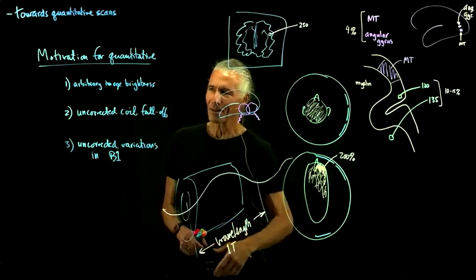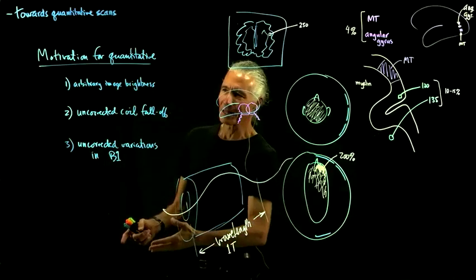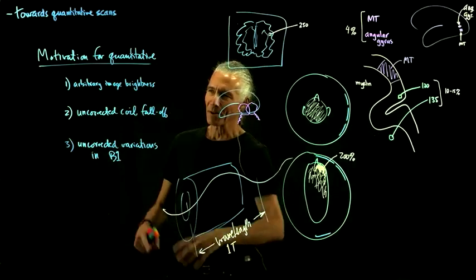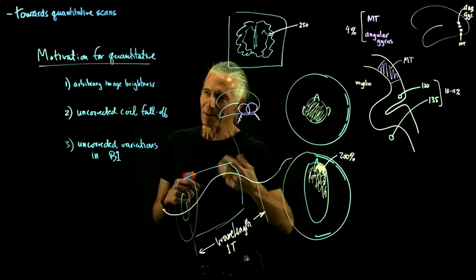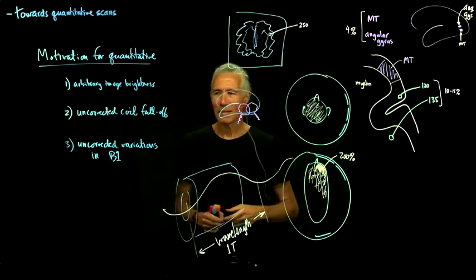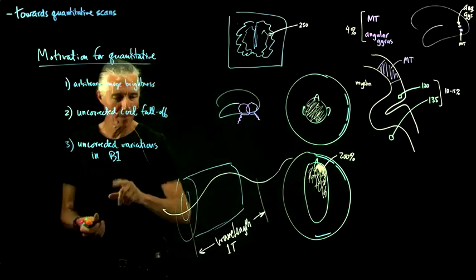If you stick your feet in the body coil and you have your head out of the body coil, and you do RF on your feet, it will resonate around in your body and make a signal come out of your head. So that's a bigger problem. So that's about the B1 field.